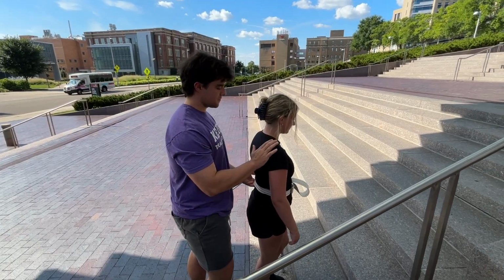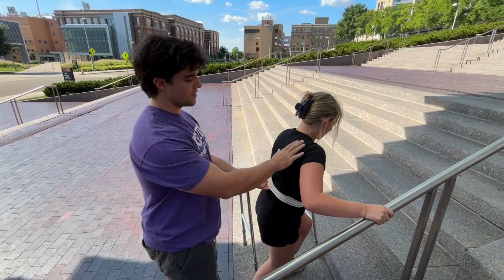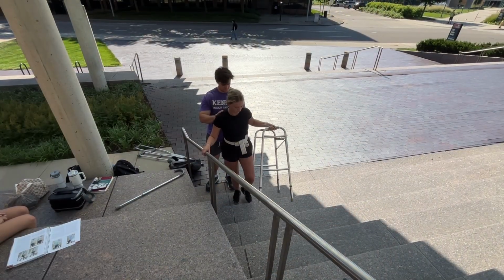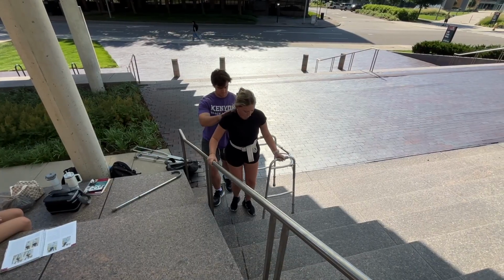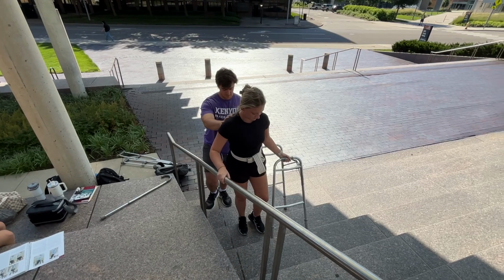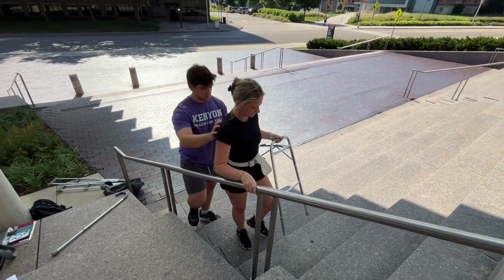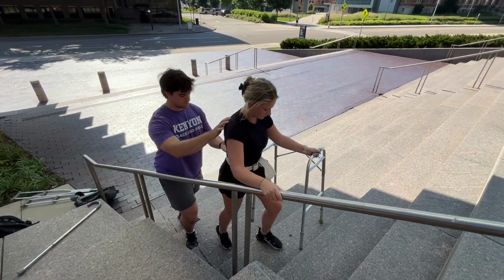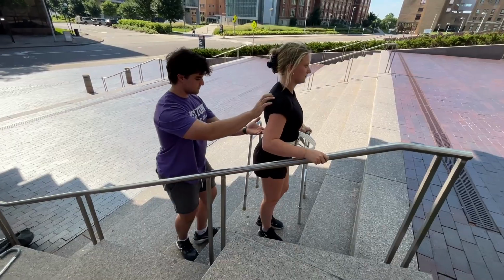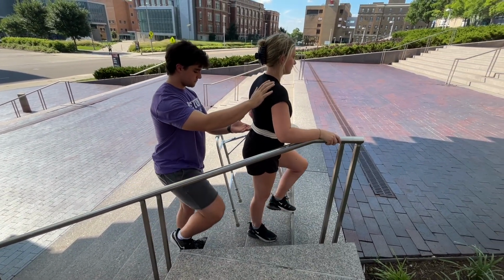When ascending the stairs using a handrail and a standard walker, the patient will start facing the stairs. They will put the walker along the side farthest from the handrail, with the closed side of the walker facing away from the body. The front feet of the walker will be placed on one step above the step on which the patient stands, and the rear feet will stay on the step that the patient is standing on. The patient will then grasp the handrail and the front grip of the walker, and they will step up with their strong foot, and they will elevate their body and then step up with the weaker foot.